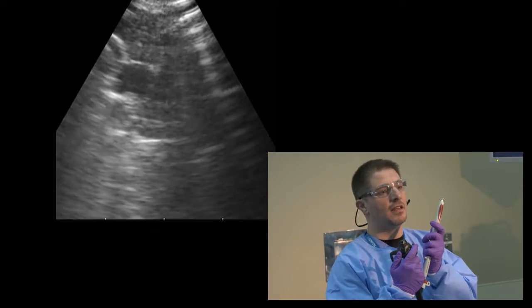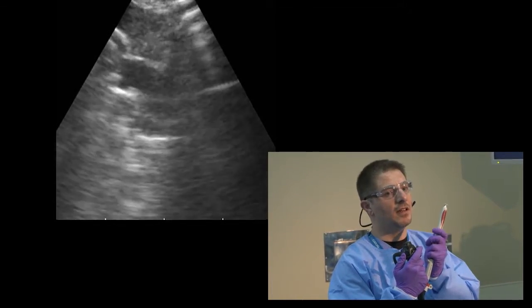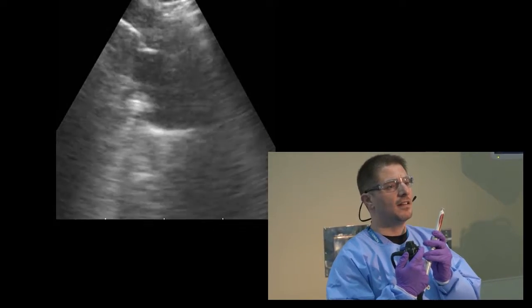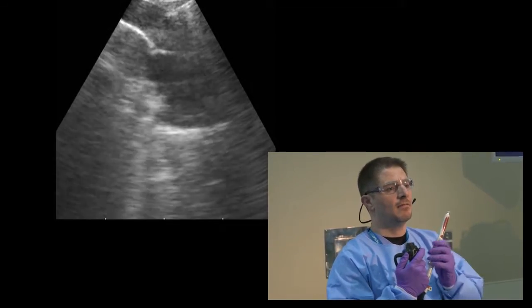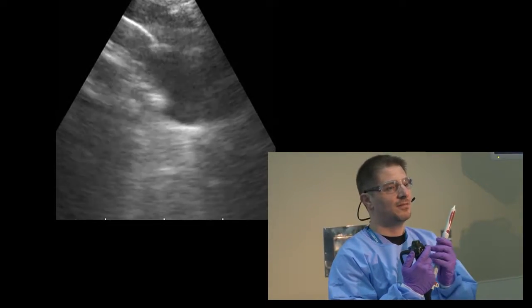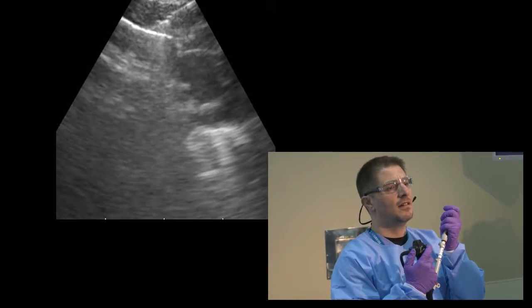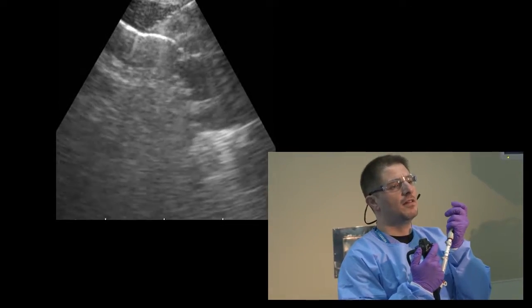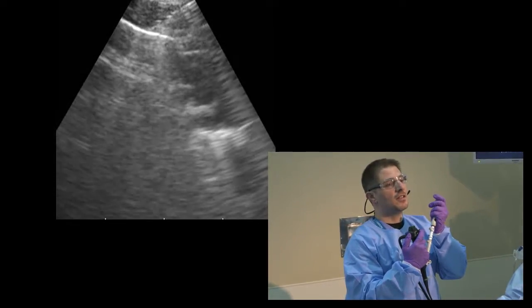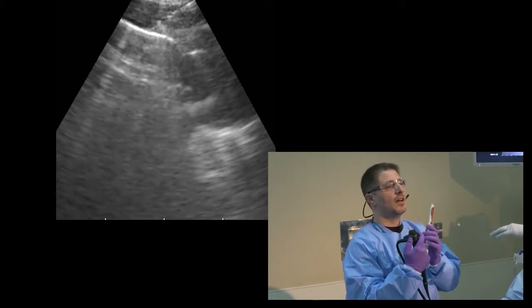You see your target, you keep it in the other half, the far half of the ultrasound, and you push the needle and see the needle getting inside. Can you hold the scope for me there? With the tube. The needle is now inside the lymph node. You clean with the stylet. Make sure that no endobronchial secretions is in the needle. We'll do just without suction.